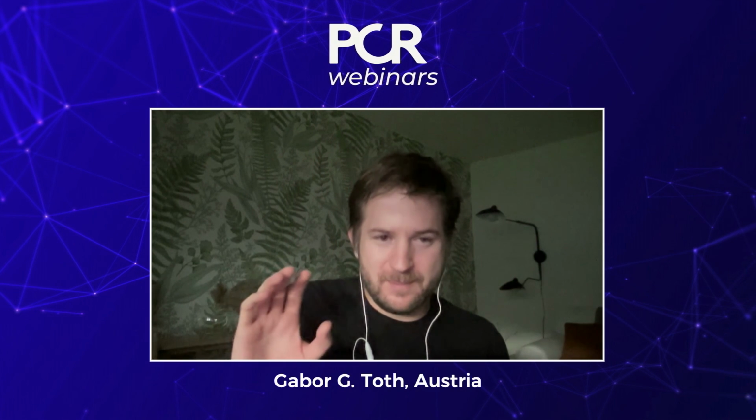Okay, so you're going to show us. I turn this question to you, Tom, quickly, just to use your imaging experience here, because I think it's a very important point that Thomas also mentioned now. I believe that everything we learned about how to use imaging to evaluate the result after a stent is completely invalid here, because of course you see dissection, of course you see some variation in the vessel lumen and so on. So how do you use imaging in your practice to assess the result after DCB, if you use it at all?